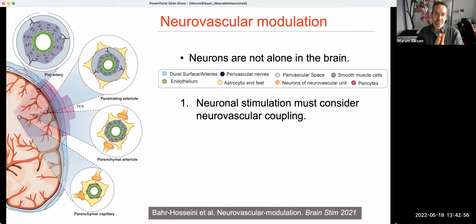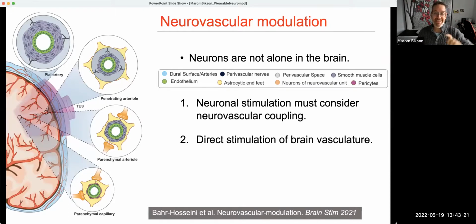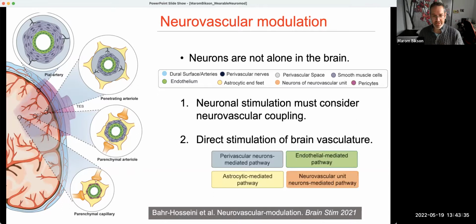And so the first aspect of neurovascular modulation is that even if we're directly activating neurons, maybe we cannot understand how we stimulate neurons without understanding this coupling. So we can't understand, for example, how electrical stimulation could boost plasticity, which it does, without also understanding how endothelial cells and glial cells are all coupled into that process. And the second aspect of neurovascular modulation is that we might actually be reversing the traditional recruitment order, making blood vessels activate first. And again, as I tried to indicate before, I think this has very interesting dimensions to it as well. And this was something we reviewed or tried to characterize in this recent paper as a concept.